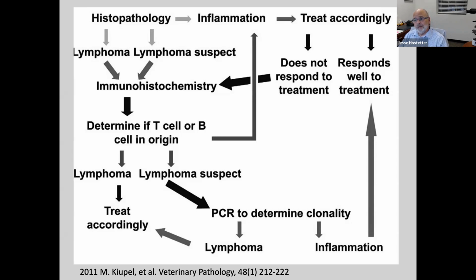It's pretty common here, and it's kind of a fungus, it sits in a funny category, but it's very eosinophil-rich with macrophages. When we start seeing that in the GI tract, we start thinking about pythiosis. And I think in other fungal diseases as well, so I wouldn't rule it out. If I see that inflammation, I recommend PAS or GMS on those. So I think the answer to your question is yes.